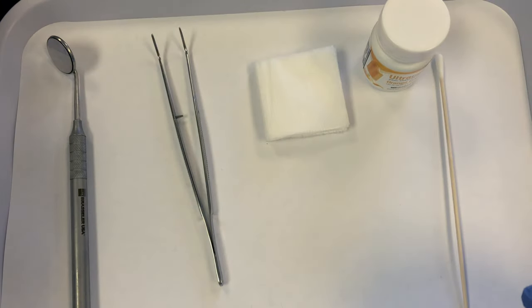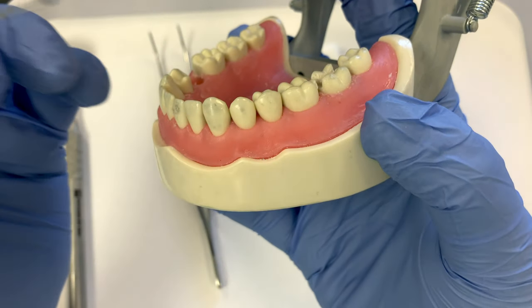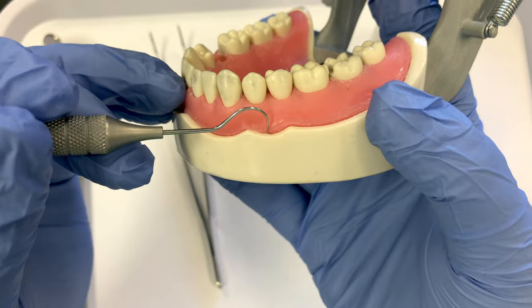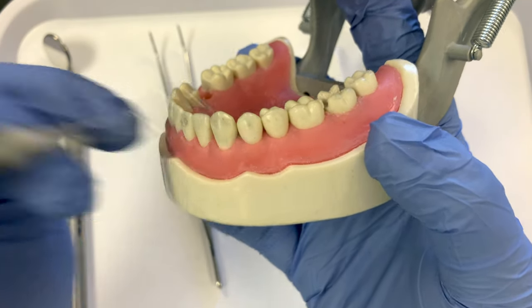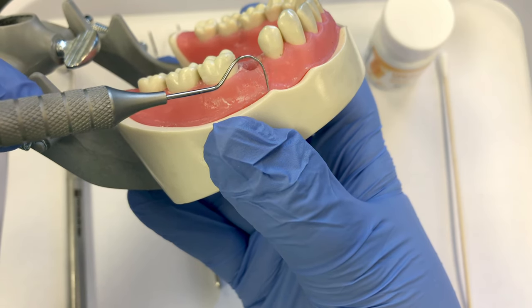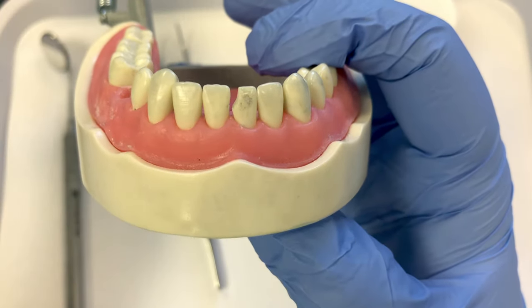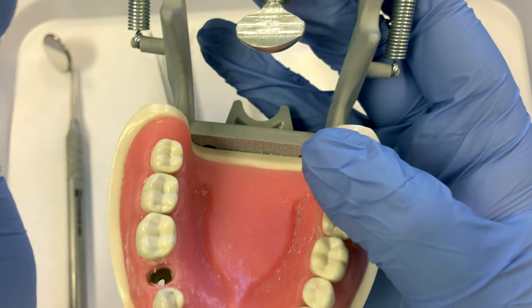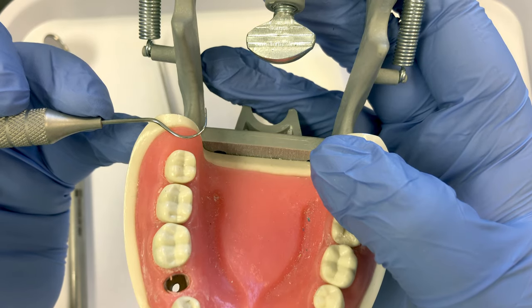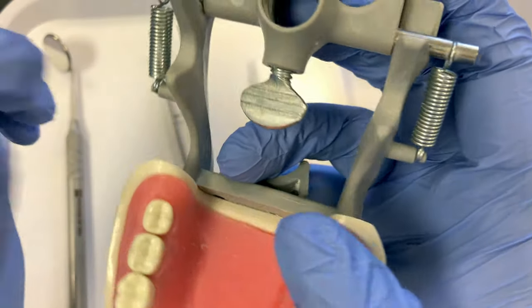With the anatomy out of the way, we can go through the actual procedure. On this model, the mental foramen is apical to the two premolars on the working side. For a mandibular infiltration of tooth number 25, you would be apical to that one tooth. The inferior alveolar nerve block would be retromolar on that particular side — lingual to the curve in the jaw, simulating where the doctor would inject.